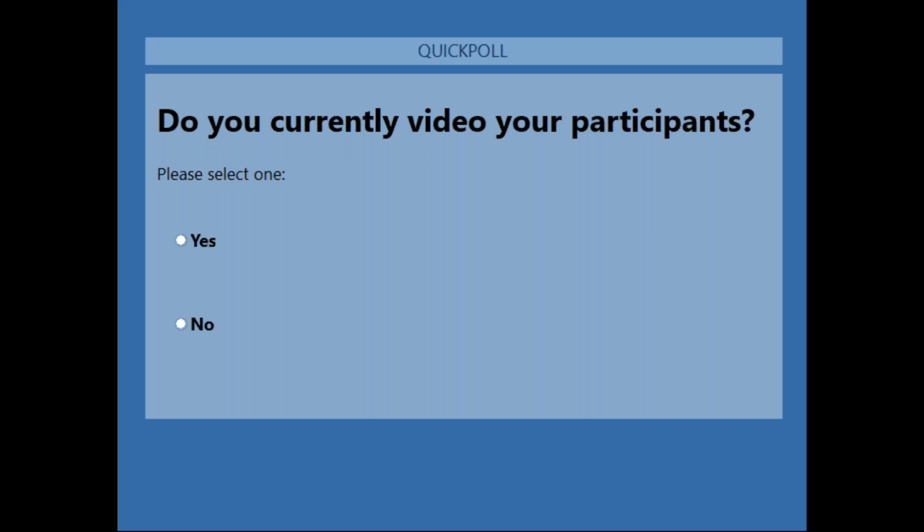Stefano already asked a question, and Frazer, I'm going to go ahead and ask it, even though I think he already covered part of this. At which frame rate can you record, and what is the video compression? What's the level of sync, or does it depend on the camera? I'm going to cover all of that. What I just set it to there was 30. I dropped it down to 20 frames per second, but you can control it: 30, 20, 15 frames per second. You also have a high frame rate camera that will record at rates of 100 frames per second.